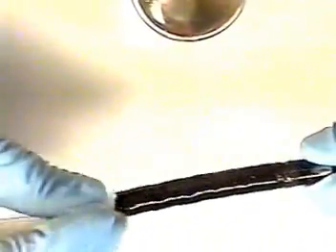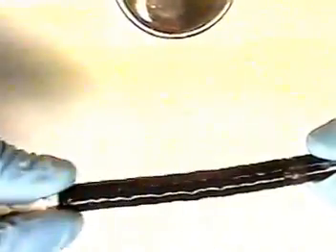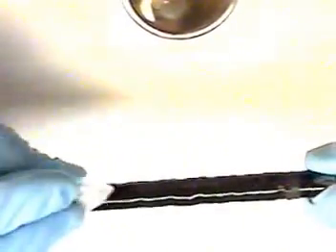Using a paper towel and alcohol, clean the bending rubber and binding joints to remove any old glue, new bending rubber sheath, and any debris, and most important, fingerprints from the bending rubber, which will make it difficult to make a proper glue binding to our new bending rubber sheath.